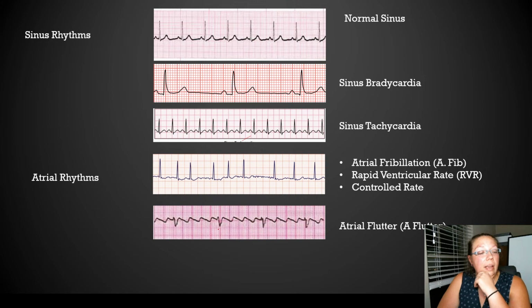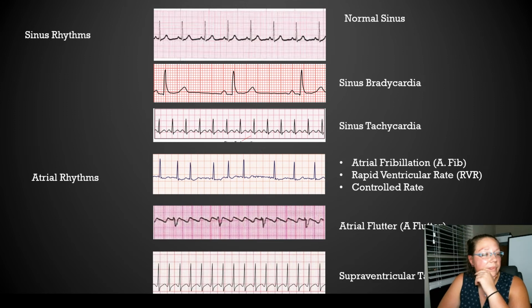And then you have QRS complexes. You don't have a PR interval because there's no P waves. And everything returns to the isoelectric line. So aflutter, you get this sawtooth. They call this sawtooth. This is my favorite. Not exactly a good rhythm, but it's still my favorite.